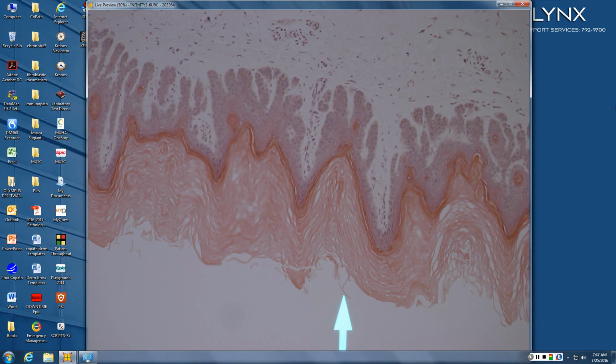Justin was probably overly nice to you and turned all the specimens so they were corneum side up. In terms of preparing to take any future exam or to sign out in real life, you need to be ready to sign out however the slide comes to you. The last thing you want to do is, on a timed test, start flipping the slide around because you can only interpret things right side up.